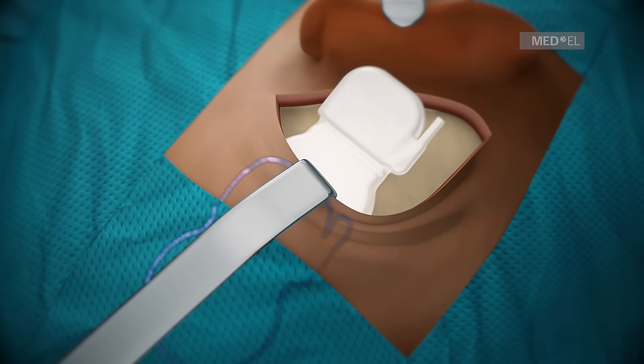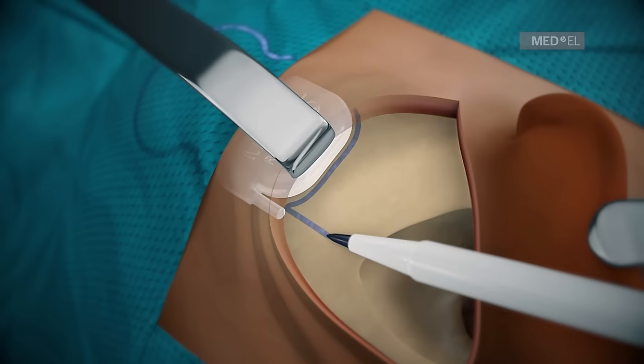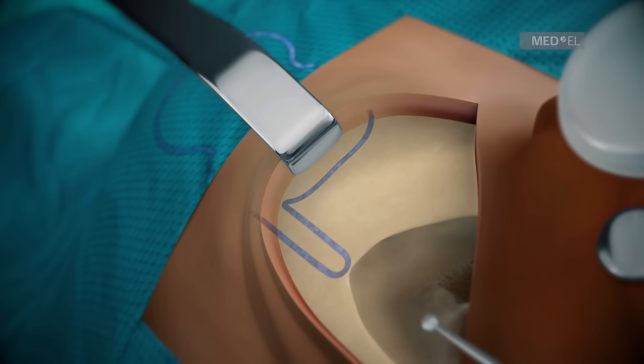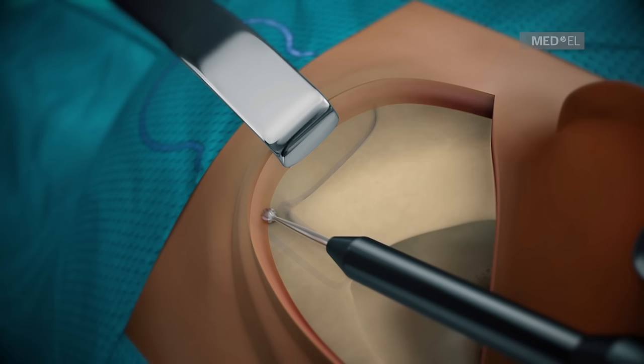Check the size and position of the periosteal pocket with the implant template pin. Mark the stimulator housing of the implant template rim and the electrode lead exit. The distance between the stimulator housing and mastoid cavity shall be approximately 10 to 15 mm. The temporal bone area must be flattened to ensure sufficient stimulator immobilization. Drill a 2 mm deep bony channel or trough for the electrode lead to protect it against postoperative mechanical damage.